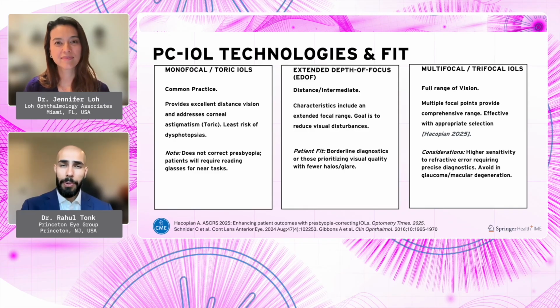And so properly measuring a patient's astigmatism, we talked about topography, we talked about biometry. We even sometimes will look at automated keratometry, refraction, what their habitual prescription has been in their eyeglasses before the cataract. All this data goes together to understand the nature, the magnitude and the axis of their astigmatism, and of course, optimizing their surface so that you get good measurements. Ocular surface disease management is critical for astigmatism management in particular. But in my view, any amount of astigmatism is worthy of treatment.